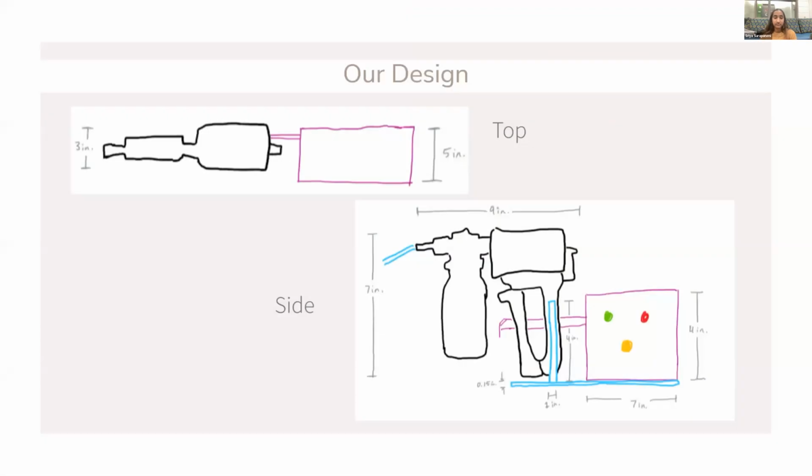Okay, so we based our design off of the MedSource manual suction pump, but optimized it through a handle and gear mechanical system. About 1 meter of nasogastric tube extended out of the baby's nose will be connected to the suction pump. A support of ABS plastic from the platform on either side of the handle keeps the pump upright and attached to the platform. So this part is the blue bar that's just on the handle part of the device. The pump's handle can be pressed to suction out the fluids, which works similarly to the syringe.